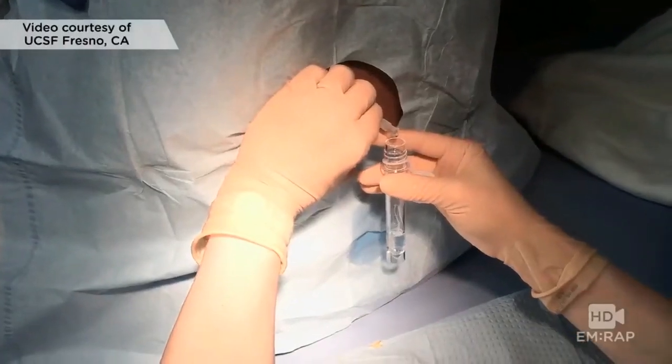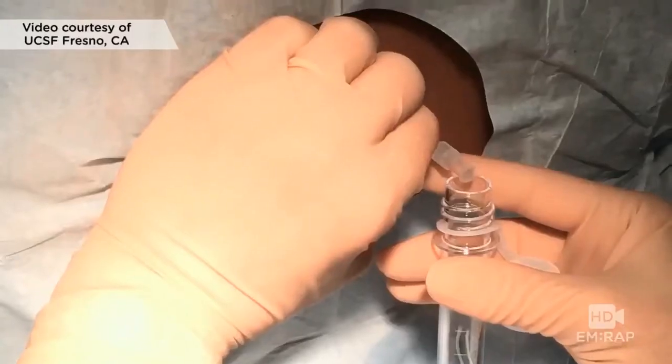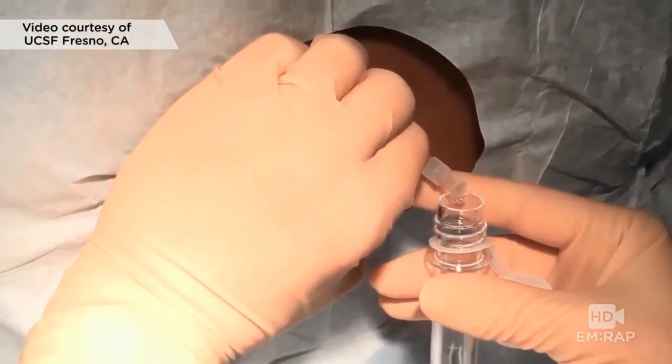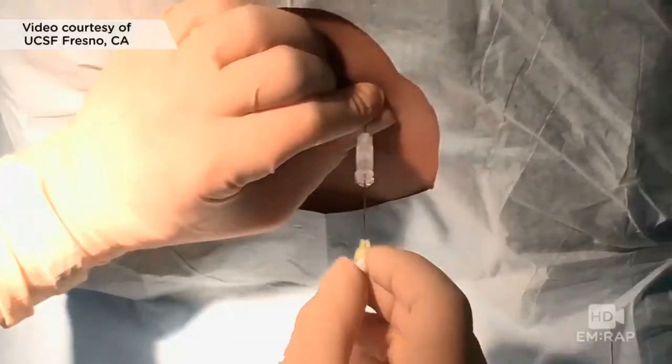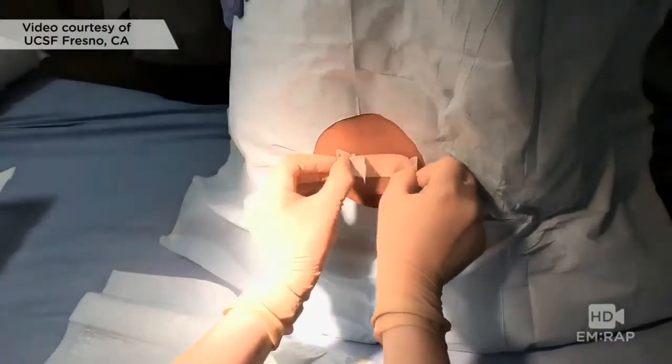This LP was pretty difficult and we ended up having to sit him upright to get spinal fluid. Normal CSF is clear. Try to collect a few milliliters of spinal fluid in each tube for testing. Remember, don't aspirate spinal fluid. Replace the stylet before removing the needle. And that's it folks — that's an LP.